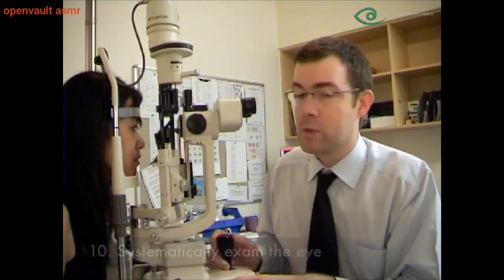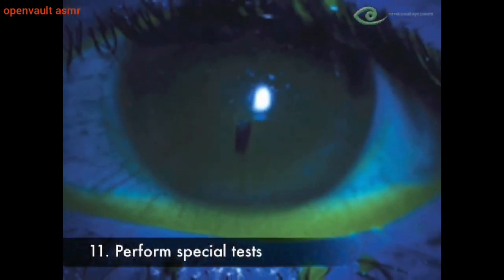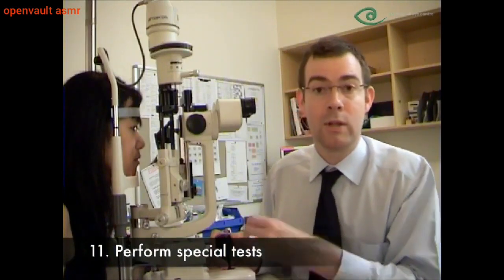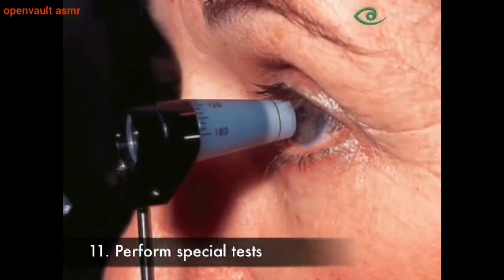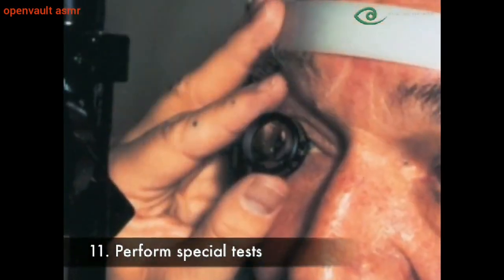You may want to perform special tests instilling fluorescein into the eye and using a cobalt blue filter to look for any epithelial defects. You may also want to put an anesthetic and check the intraocular pressure. With more experience, you can also use special lenses to examine the fundus.